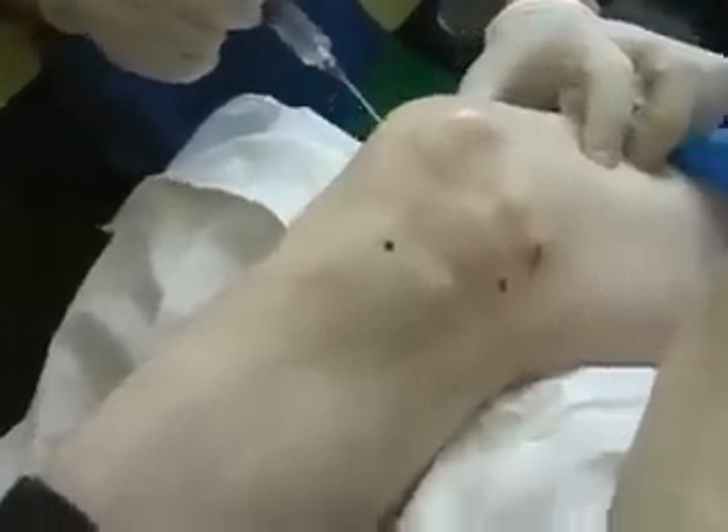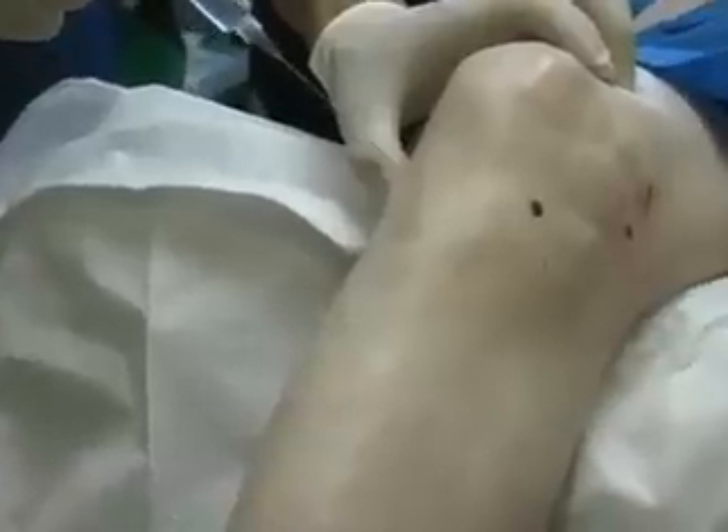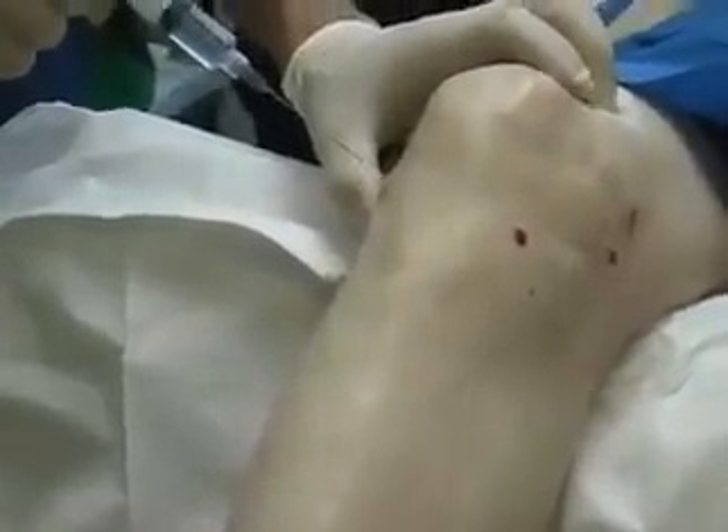So it's really important to treat all the structures around the knee — such as here I'm doing the lateral collateral ligament. As you can see, the whole procedure takes a minute or two. It shouldn't take a lot of time, it shouldn't be very painful. The process is very well tolerated and very effective for relieving chronic knee pain.